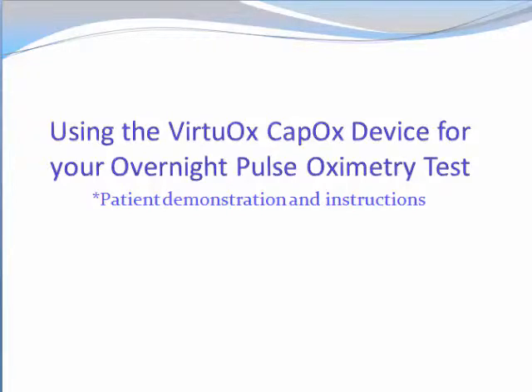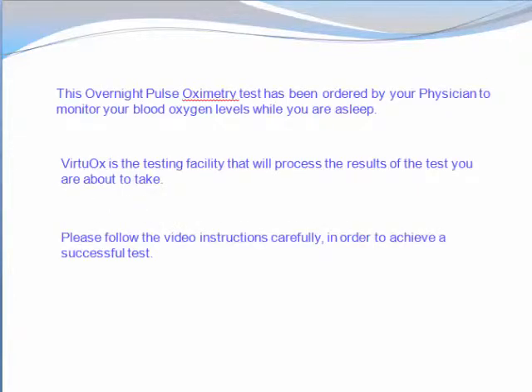This is the patient demonstration and instruction video for using the VirtuOx CapOx device for your overnight pulse oximetry test. This overnight pulse oximetry test has been ordered by your physician to monitor your blood oxygen levels while you are asleep. VirtuOx is the testing facility that will process the results of the test you are about to take. Please follow the video instructions carefully in order to achieve a successful test.